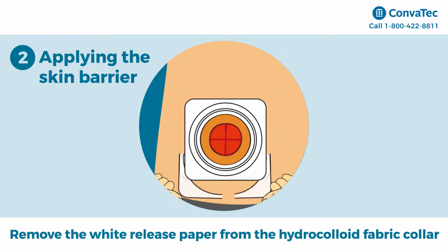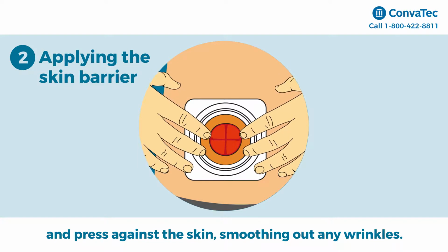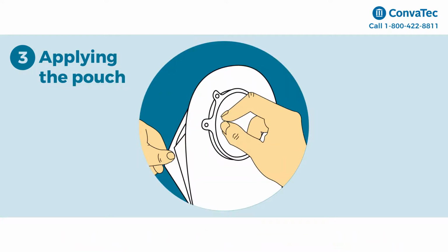Remove the white release paper from the hydrocolloid fabric collar and press against the skin, smoothing out any wrinkles. Step 3. Applying the pouch.